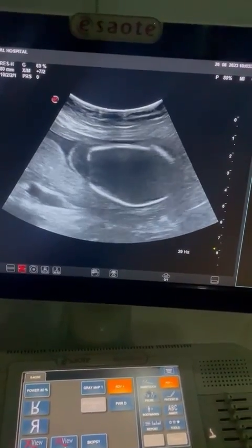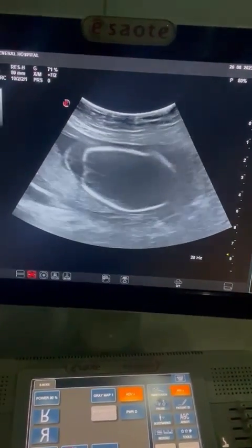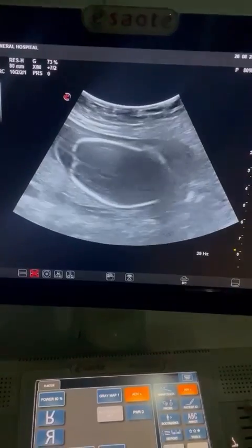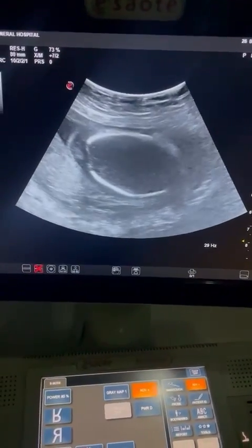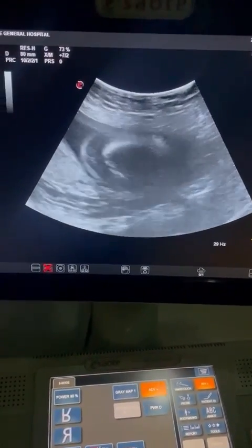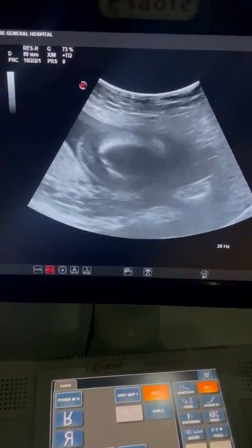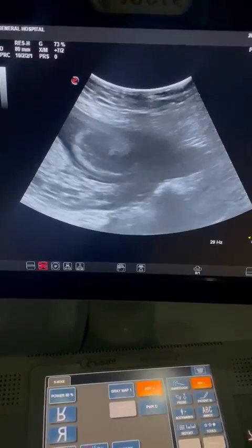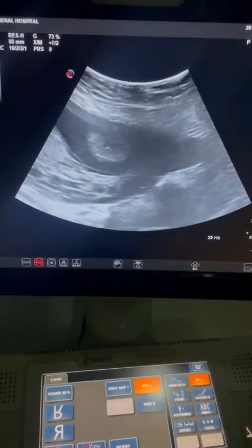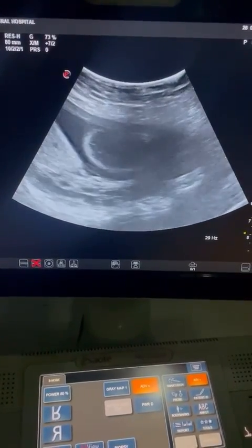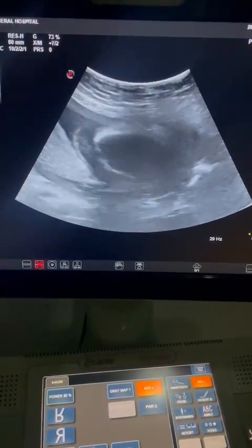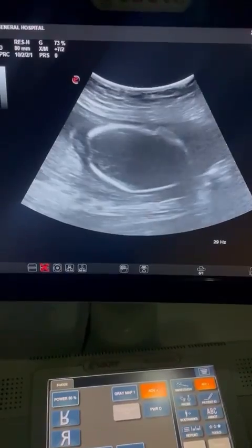Hello and welcome to another video of my YouTube channel. This patient presented to me for antenatal care and increased fetal movements, so we did an ultrasound.